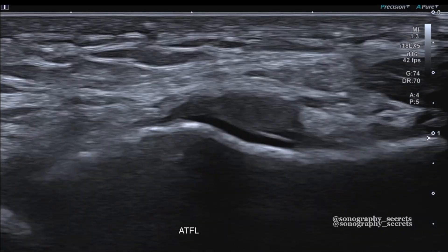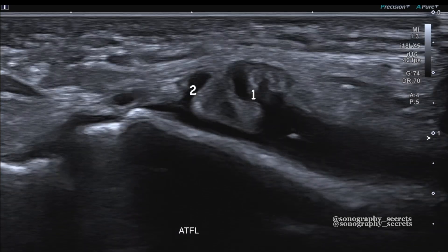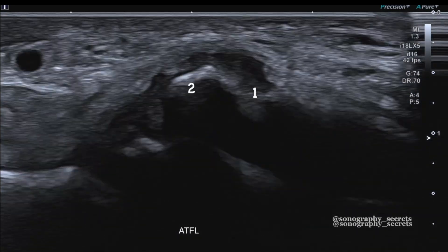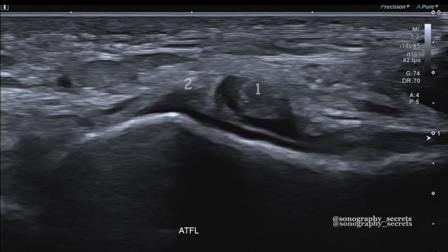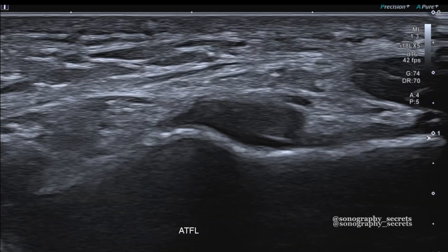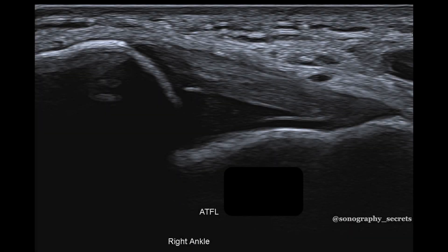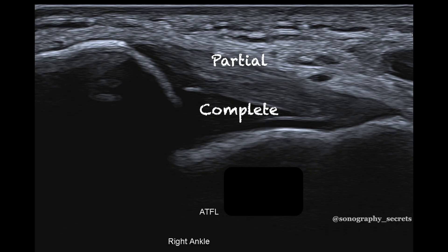The ATFL is more often than not multi-slip. To appreciate this, we can simply scan in short axis, where we can easily identify a single, double, or sometimes triple slip or band of the ATFL.